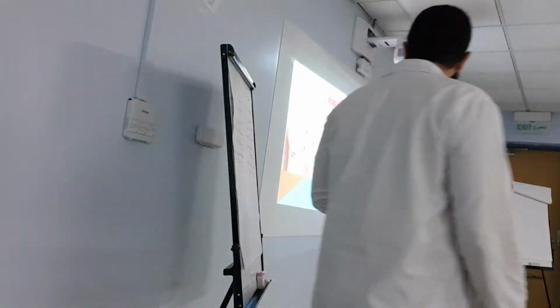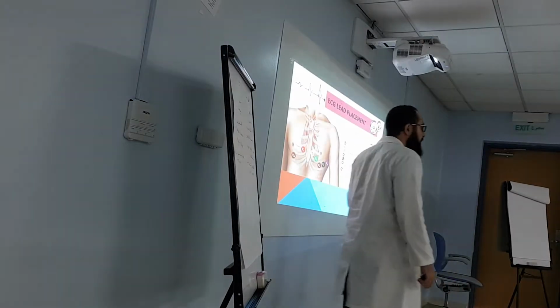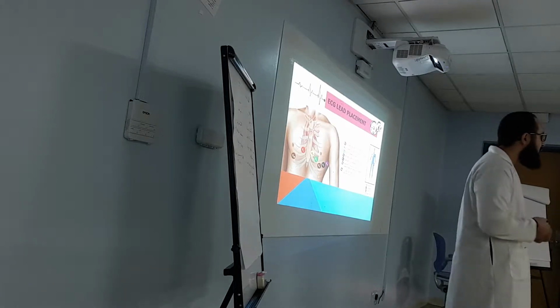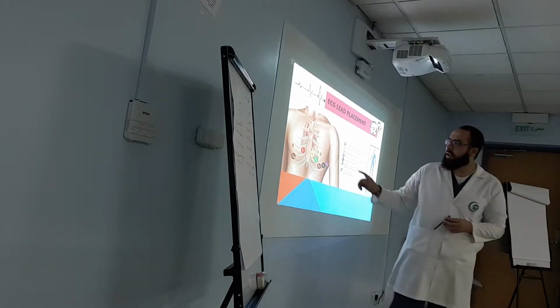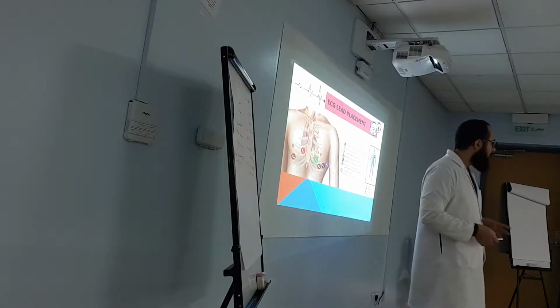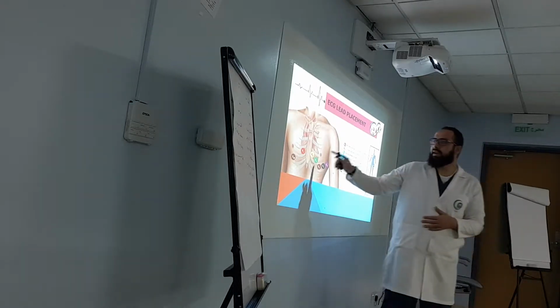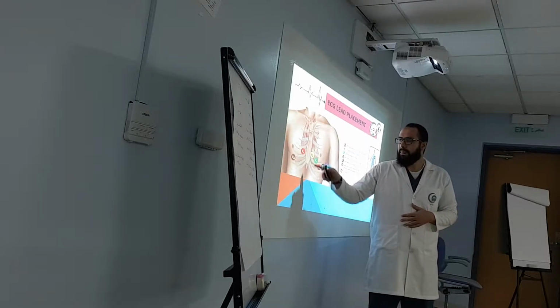First, we'll see the lead placement. It's important to put the leads in the right position, because as Mr. Eric explained, it's electricity. Electricity goes in directions. So you want to catch electricity that's coming from the heart. All organs produce electricity. So you want the electricity coming from the heart, so you want to put it in the right position. So this is the right position.